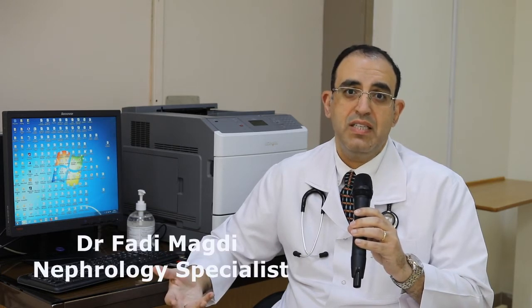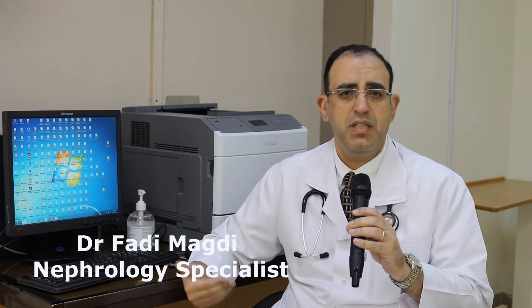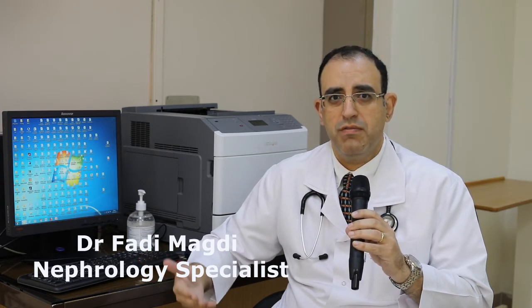So now we can measure the Kt/V every session, and this in fact is a plan of our quality group to monitor the patient's Kt/V session by session to get the best Kt/V we can get. We can modify the hemodialysis prescription, for example, increasing the time, using a better dialyzer to get the best outcome through the Kt/V formula.